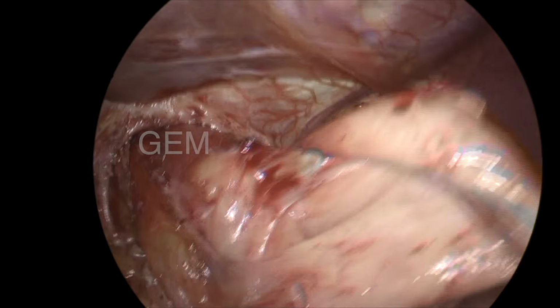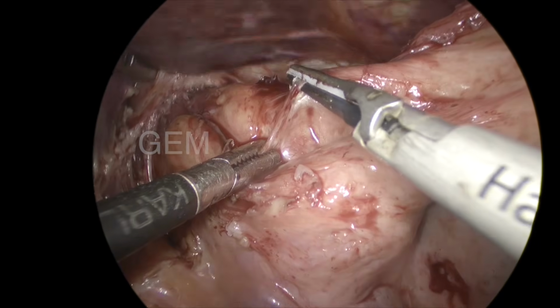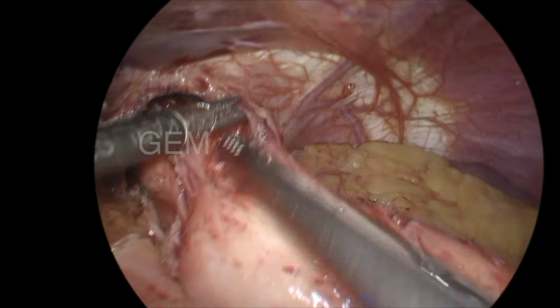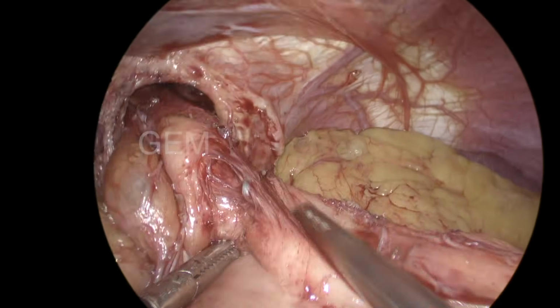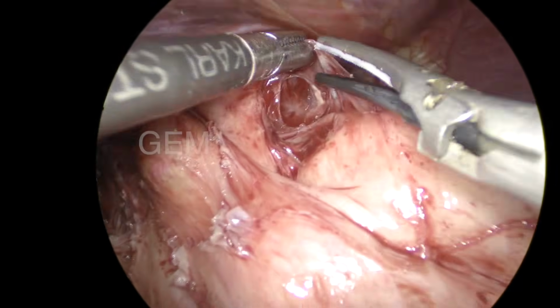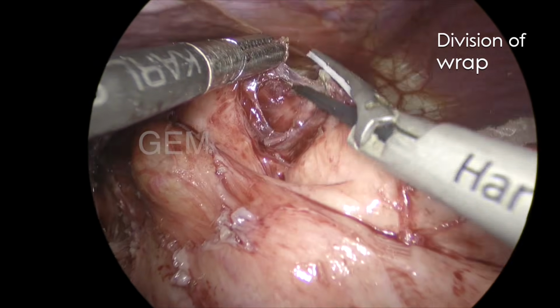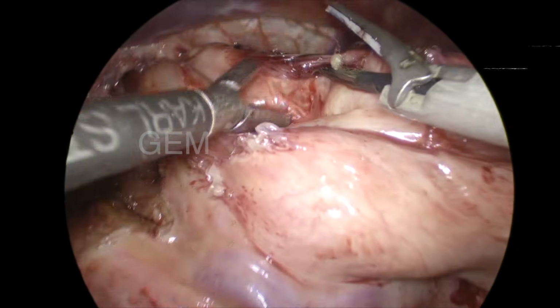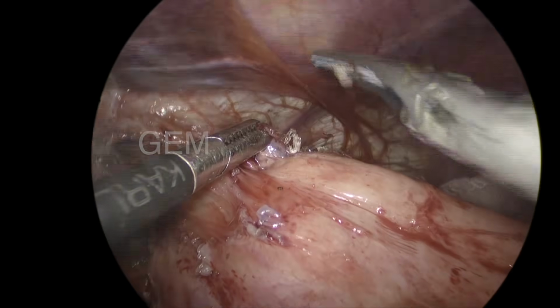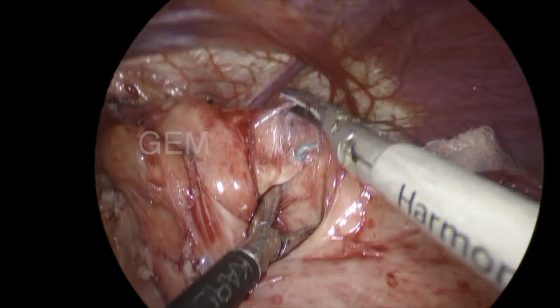So now you can see the wrap with the suture. It looks like a polyester suture, Ethibond suture. So I'm dividing the suture. I'm basically disrupting, there is a division. I'm doing a division of the wrap. We should not injure the gastric wall. That is also very important. If it is a mild injury, you can suture, but our aim is not to injure any structure.